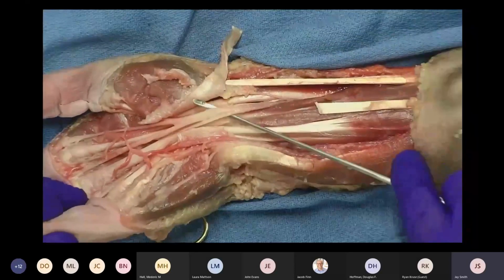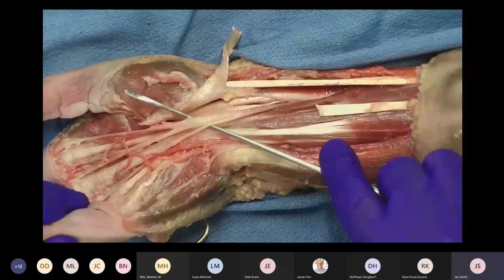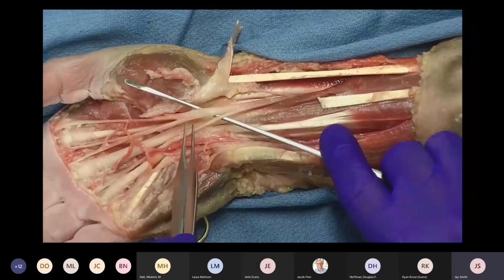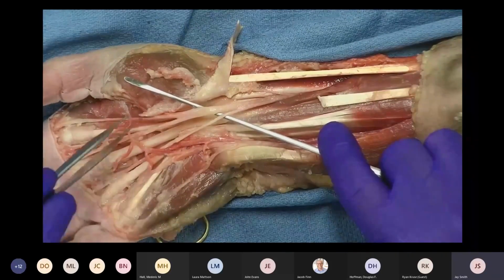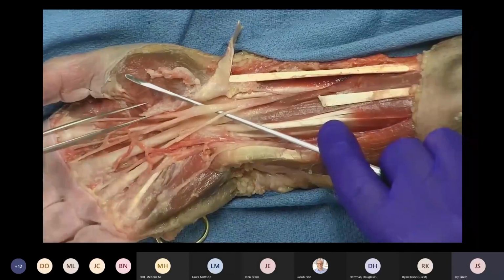As we get into the distal carpal tunnel region, this actual specimen has an early division of the third common palmar digital nerve. So this is the third common palmar digital nerve. The median nerve will divide up into its digital branches, its terminal branches, which are the 3 digital branches, third, second, and then the branches into the first web space. And also importantly, as we're going to see now, the recurrent motor branch.